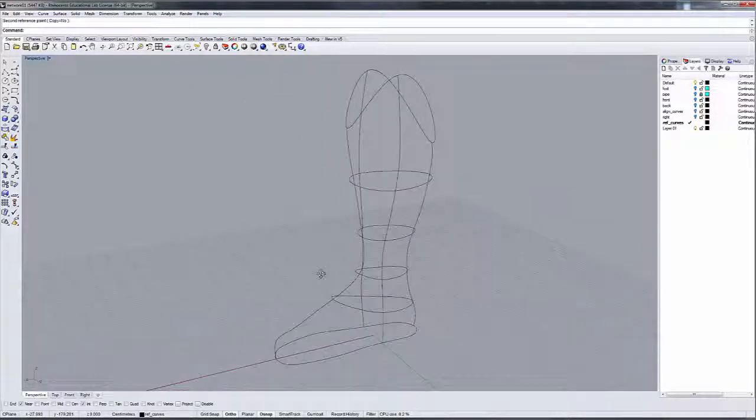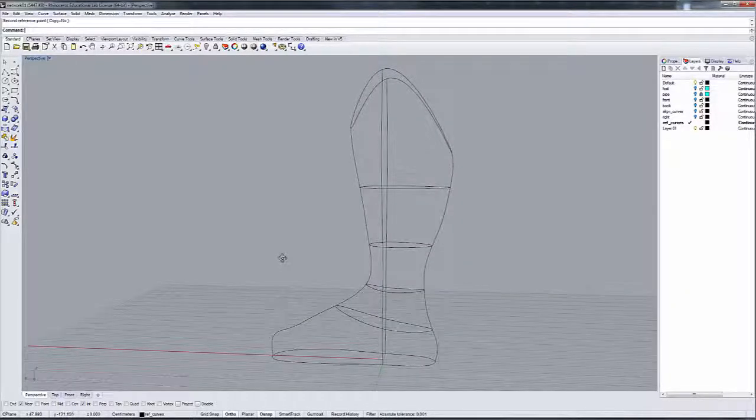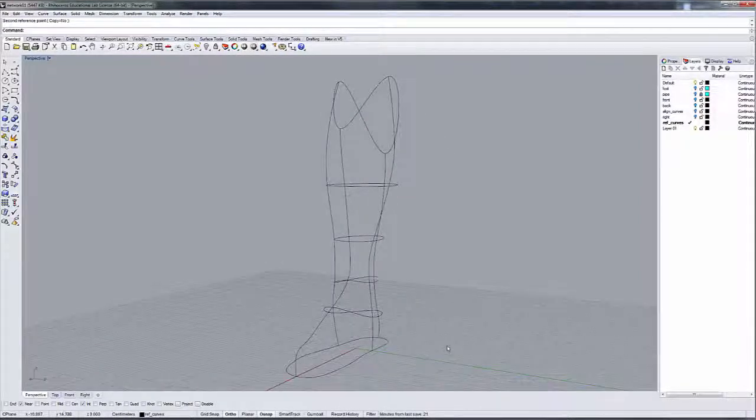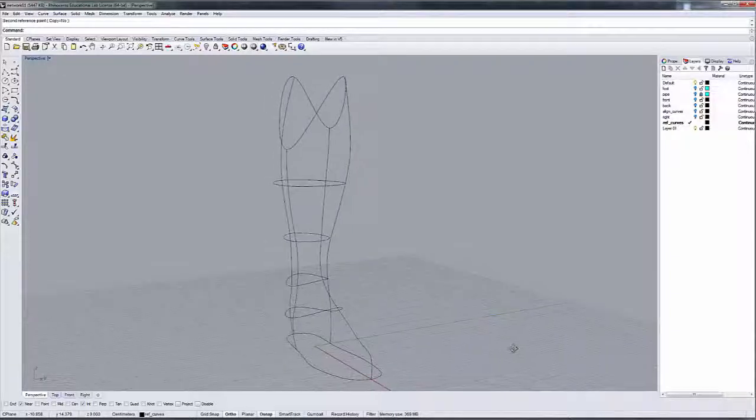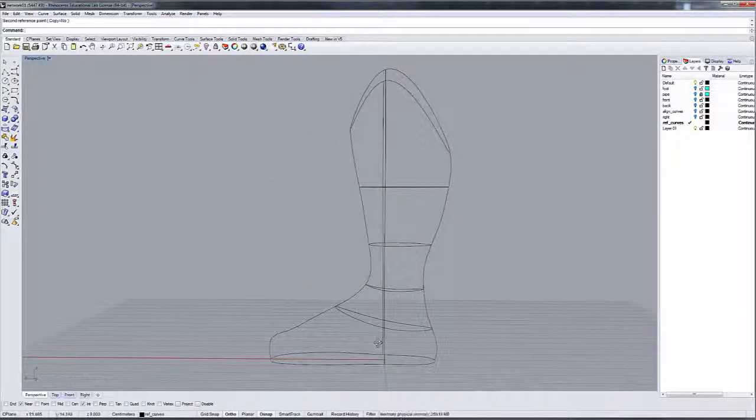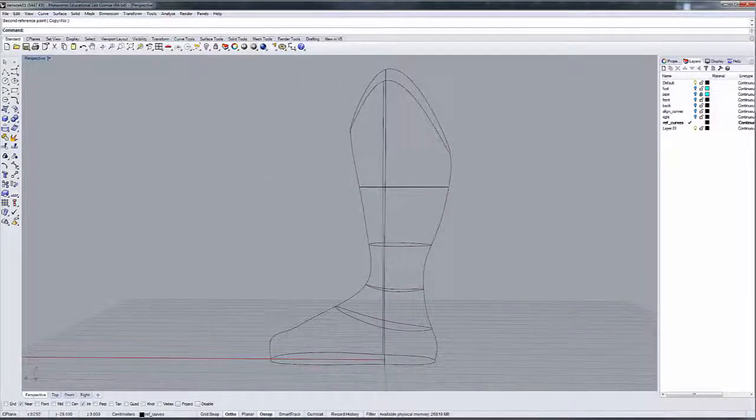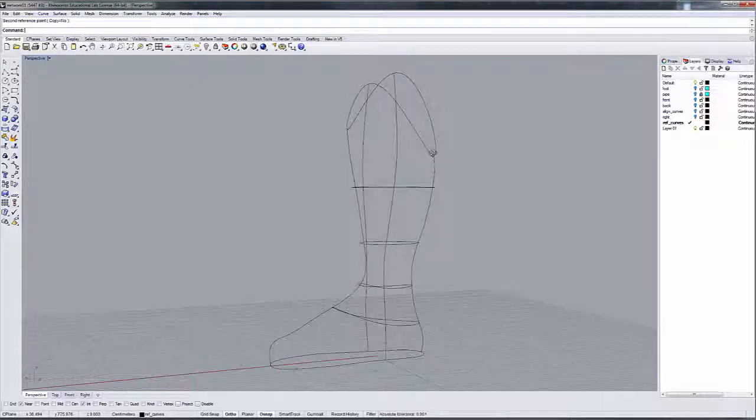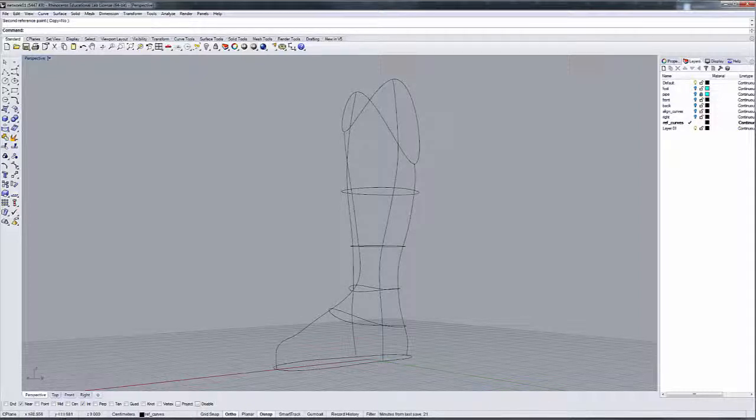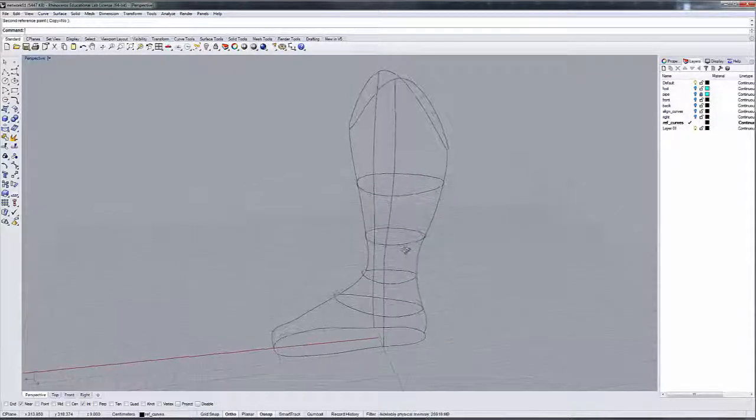A network surface is a surface created by a series of overlapping curves in two different directions. In this case, these curves define the vertical shape in this direction, and then we have this set of curves that transform in the horizontal direction.